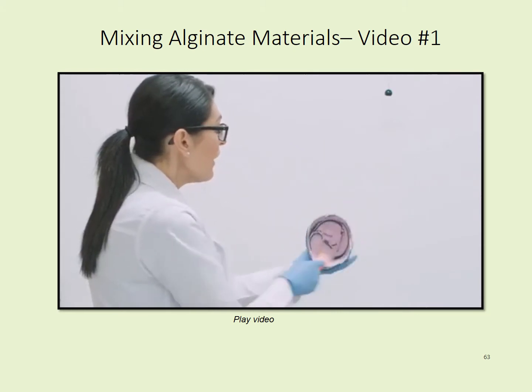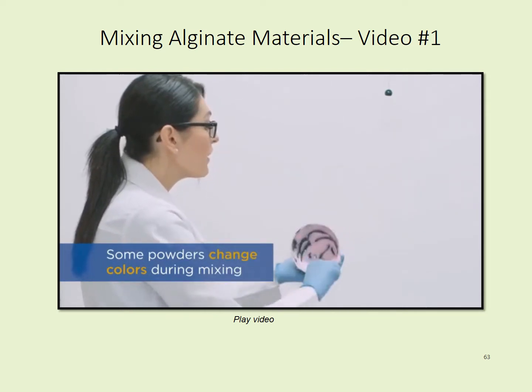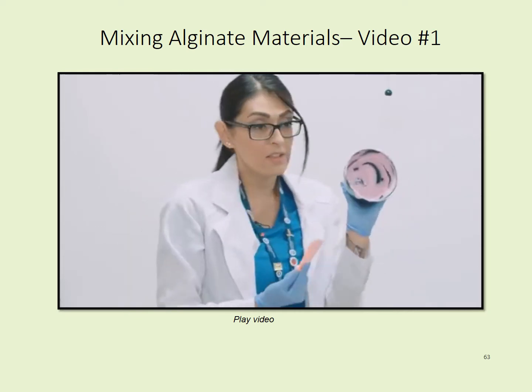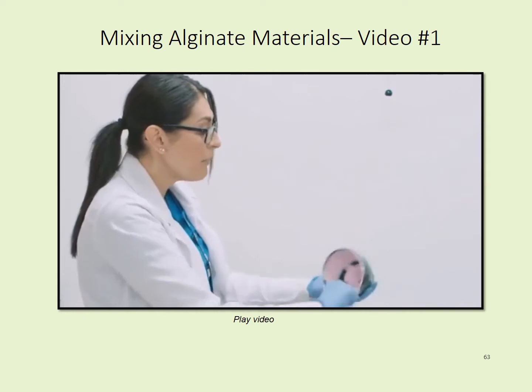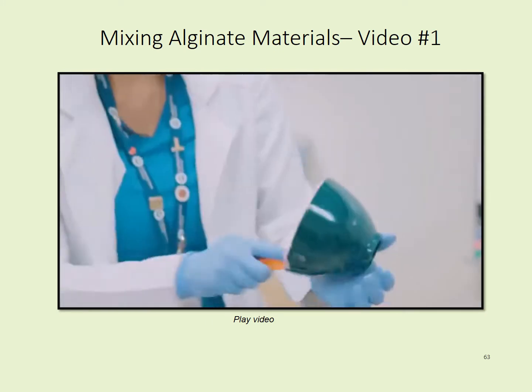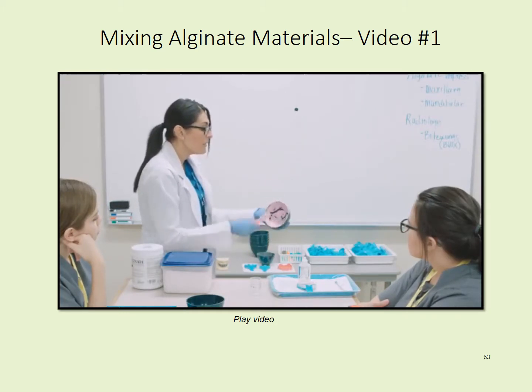Now, if you guys notice, the powder turned pink, then it turned purple, and now it's turning light pink again. So this particular powder starts to turn white when it's setting, okay? So as you can see, the consistency now is a lot smoother, okay? So again, I'm using the side of my bowl and turning to push down and mix this material. And again, this is why the bowls are rubber the way that they are. So we're mixing here. Once you feel like the mix is mixed all the way, there's no clumps, there's no dry powder, you can then scoop it into the alginate tray.